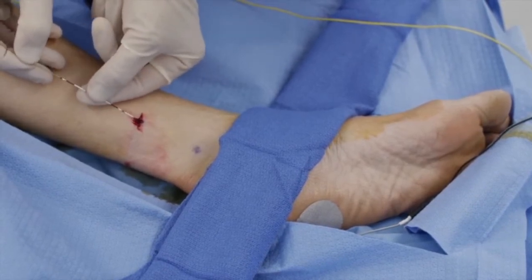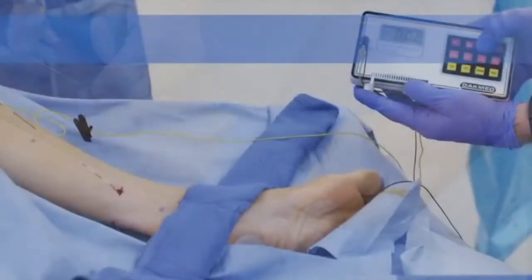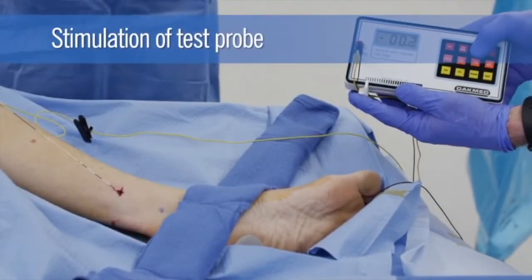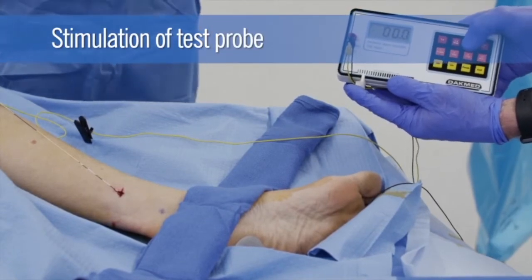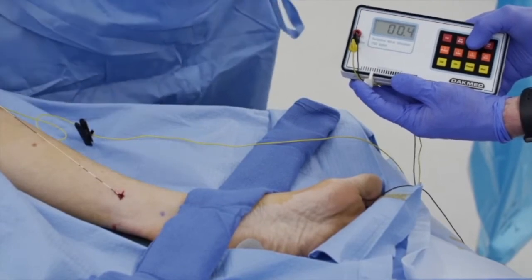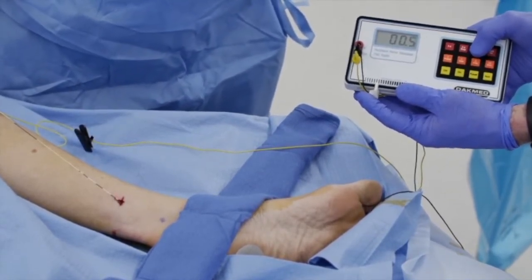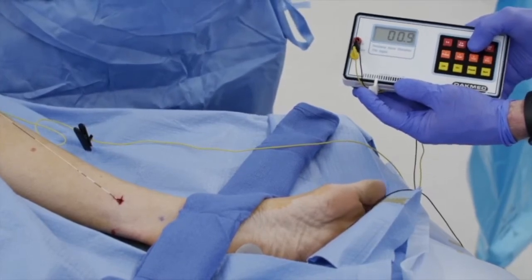You should experience a pop as you pass through this fascial layer. The correct positioning of the test probe is confirmed with electrical stimulation. If the lead is in close proximity to the nerve, the patient will both be able to experience the stimulation from the probe with subsequent toe fanning or flexor digitorum brevis muscle twitching.